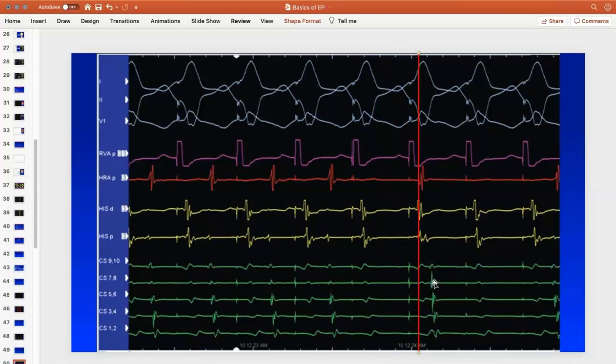Okay. So this is your A. Coronary sinus proximal. Okay, what about this? This followed this coronary sinus. So it is between the sinus and... Let's take a step back. So we say that these ones conduct, okay? This is locked. We see an A here. Where is this A coming from? We draw a line. This is the A from the area between the coronary sinus and the right atrium.